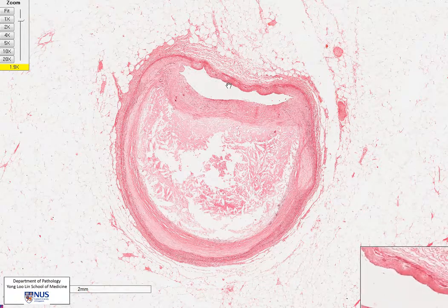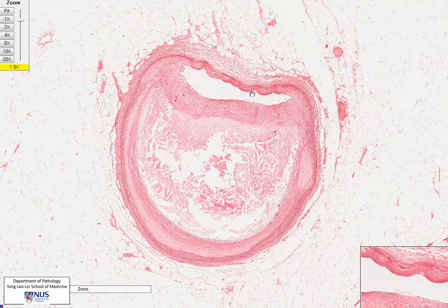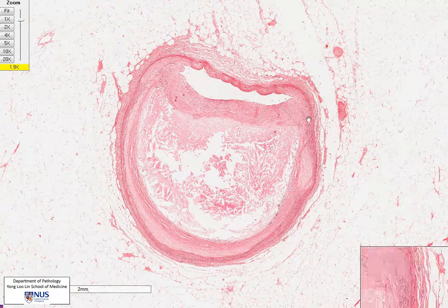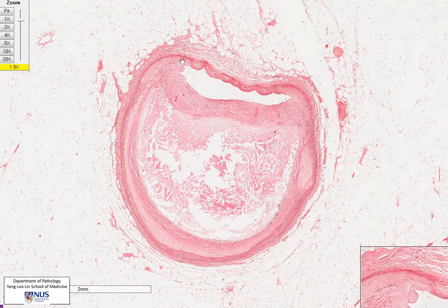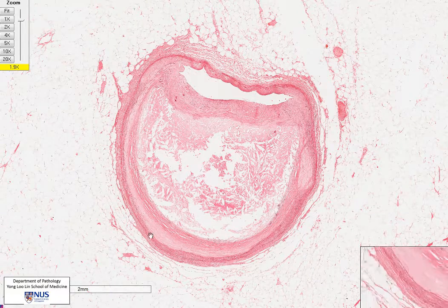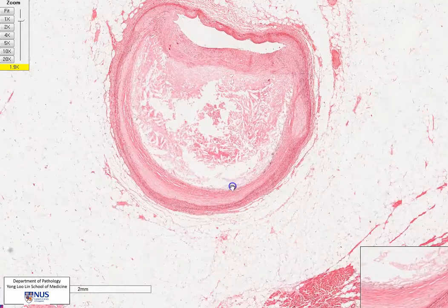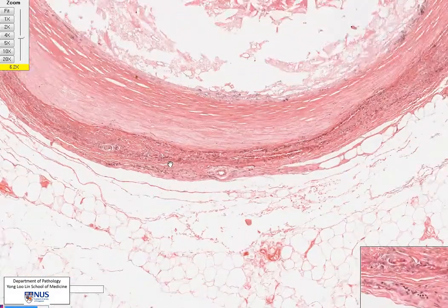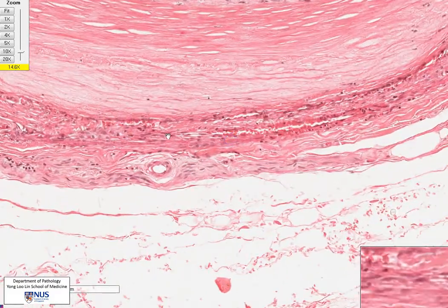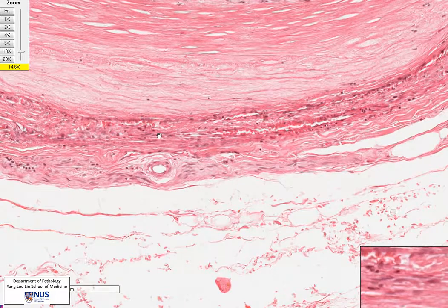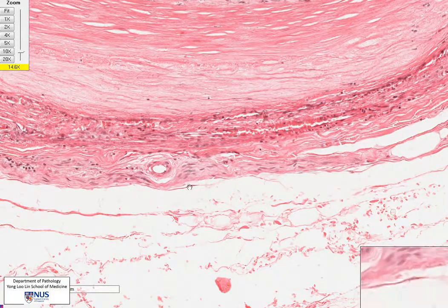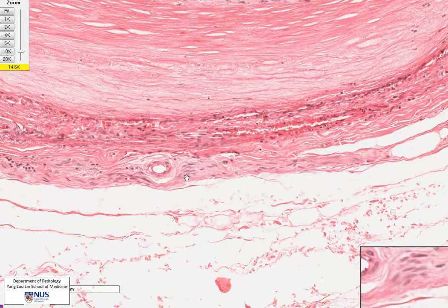Here we can still see the endothelial lining — this is the tunica intima. And this darker red line, which I will trace here now, this is the tunica media, which is the smooth muscle layer. You can actually just appreciate some of the spindled smooth muscle cells with the densely pink or eosinophilic cytoplasm. And just beneath that is the adventitia.